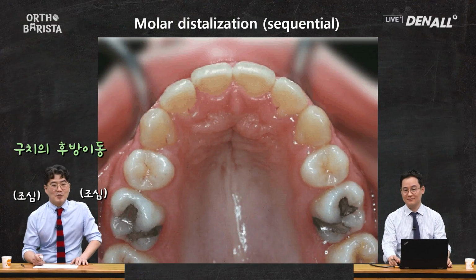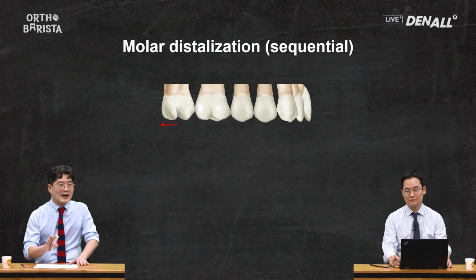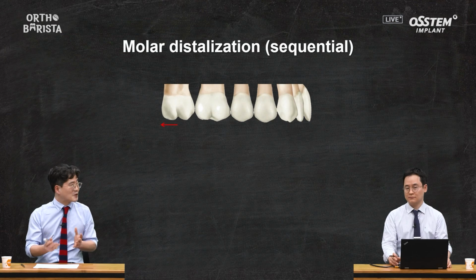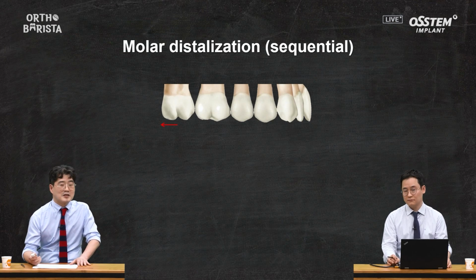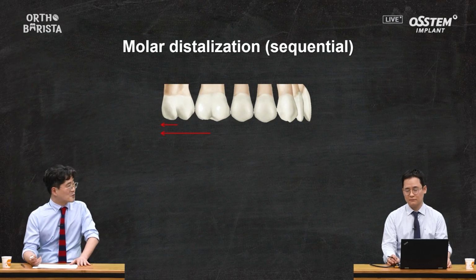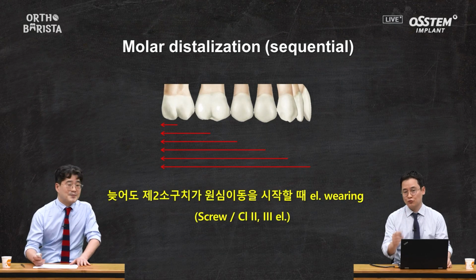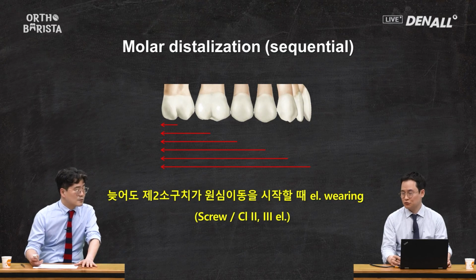In aligner therapy, molar distalization is approached slightly differently compared to bracket-based orthodontics. Typically, movement begins with the number 7 tooth. Once the tooth has moved about halfway, the number 6 tooth starts to move. Similarly, when the 6th tooth has moved halfway, the number 5, number 4, number 3, and number 2 teeth follow the movement in sequence. The halfway concept refers to incremental movements relative to the target distance for molar distalization.